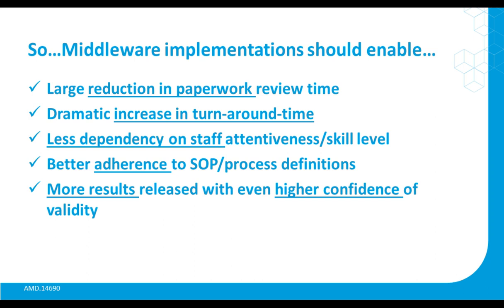By my estimates, on average, an average run of viral load testing, let's say it's around 50 samples, probably has about 20 minutes of paperwork review. And I'm not saying it's discounted and not valuable, but there are ways to automate that to recover much of that time, to remove the human element. You're also less dependent on staff and attentiveness and skill level. I've been at several institutions where if the primary operator is gone, someone else who's less skilled has to operate. And in that situation, they probably experience a little bit of a lessening of the service level.